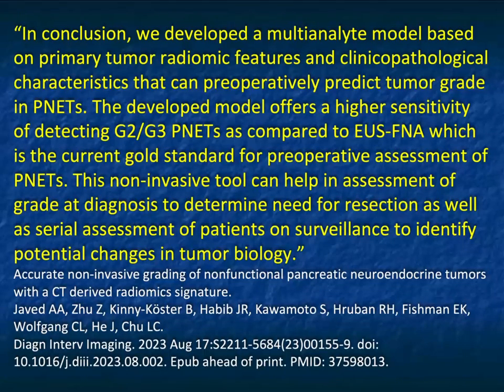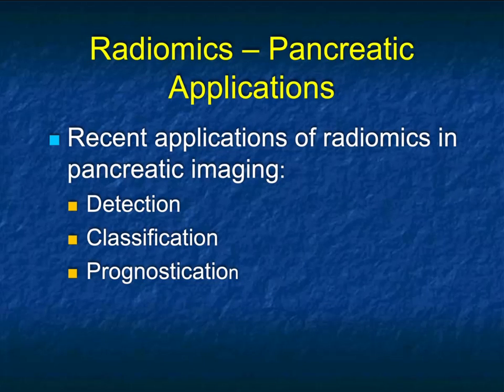And now under 2 cm for neuroendocrine tumors, people will simply follow. And it ends up that radiomics is better than EUS with biopsy and pathology, because often you don't get the right pathology when you sample the tissue. With radiomics, we're looking at the entire process, and so radiomics for neuroendocrine tumors is actually more accurate.